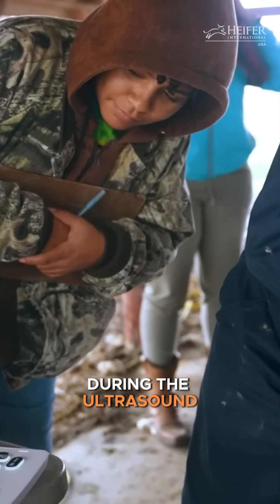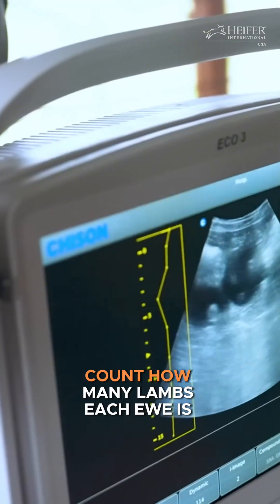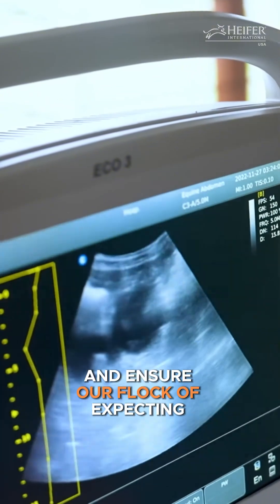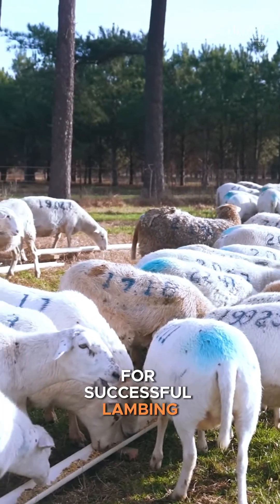During the ultrasound, we can see the developing lambs and their heartbeats. That means we can count how many lambs each ewe is carrying and ensure our flock of expecting mamas get the care and nutrition they need for successful lambing.